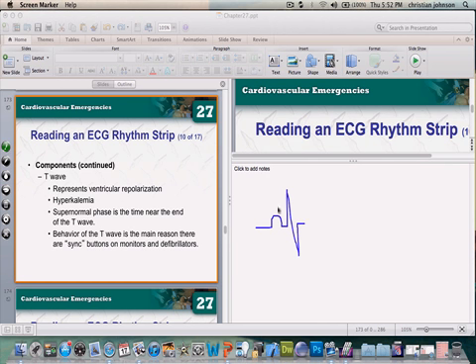Going on to our T wave. Like I said earlier, your T wave is kind of like the stepchild of all the waves because we don't technically use the T wave to diagnose what the rhythm actually is. But we can utilize the T wave to tell other things that are going on. You'll see a nice peaked T wave like that, where it kind of looks like it hurts to sit on. Ow. If your patient is, say, hyperkalemic. Or you might see a nice big, broad, tall T wave when you're looking at early repolarization. And we're going to get into all that sort of thing in a different episode.